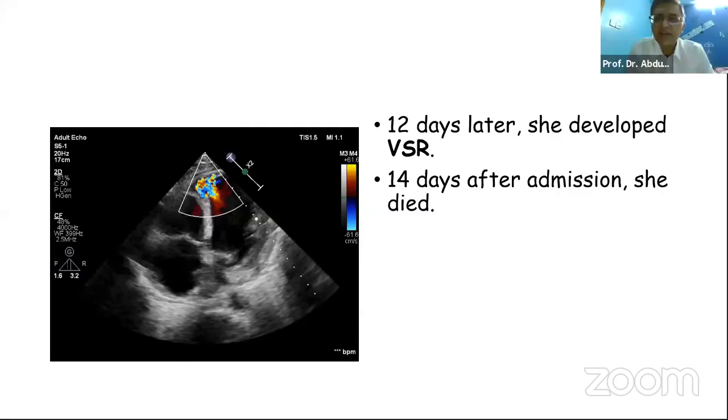Sir, can I add another question? Was the TPM somehow responsible for the VSR in the apical part? The perforation looks like it is in the septum, right? Yes. It is unlikely that a temporary pacing catheter will cause septal perforation. I think this is related to the acute myocarditis, unless Hafiz has any other comment.